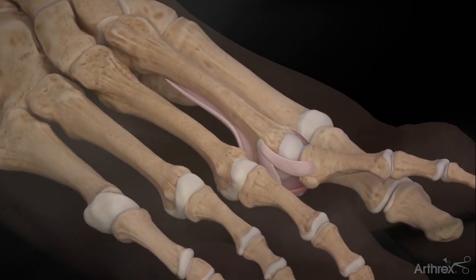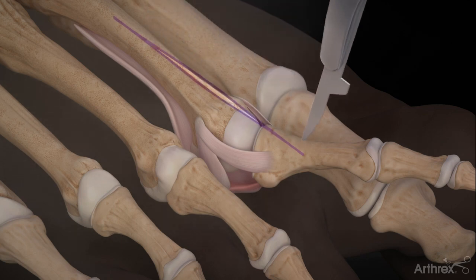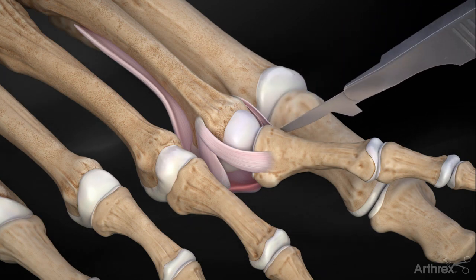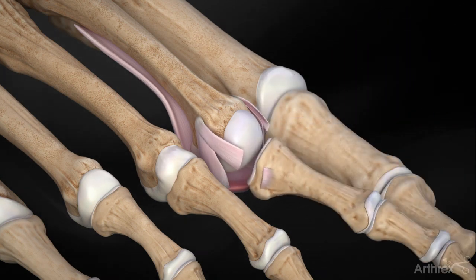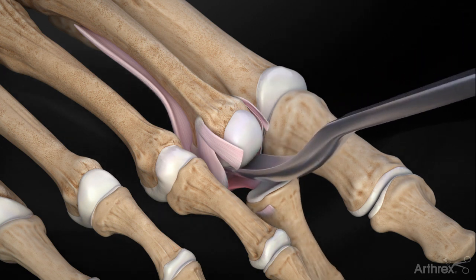The plantar plate internal brace ligament augmentation procedure for plantar plate pathology. A dorsal incision is made directly over the MTP joint. Excise the collateral ligaments at the base of the proximal phalanx. Use the McGlamrey elevator to release the plantar plate and capsule proximally.